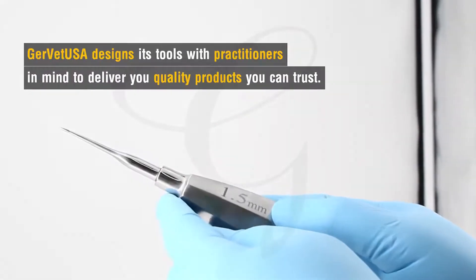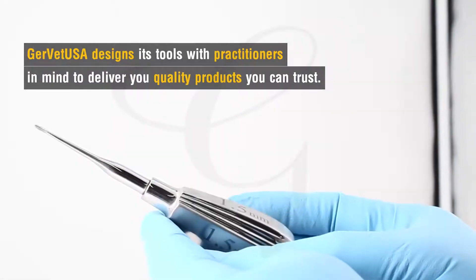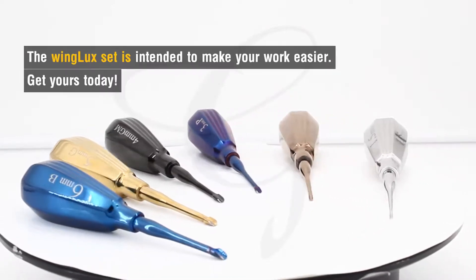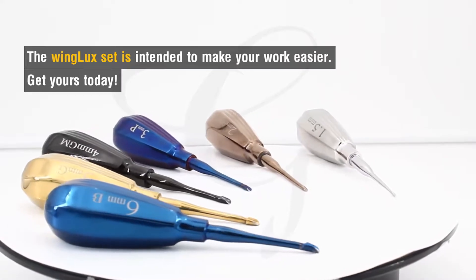Gervet USA designs its tools with practitioners in mind to deliver you quality products that you can trust. The WingLux set is intended to make your work easier, so get yours today.